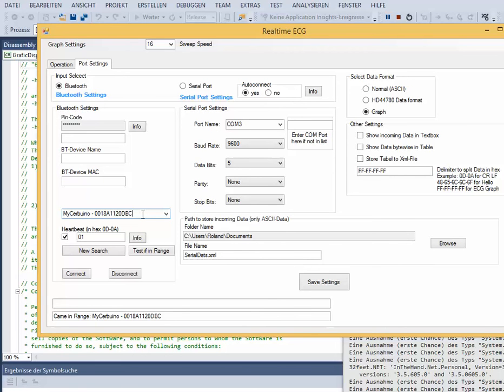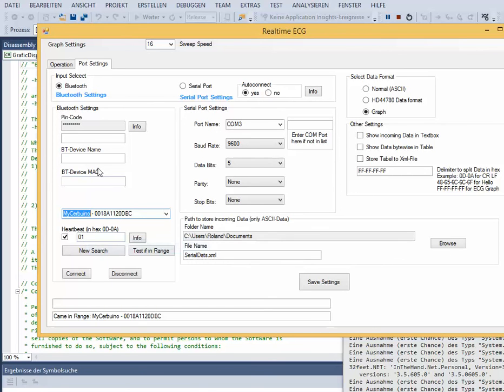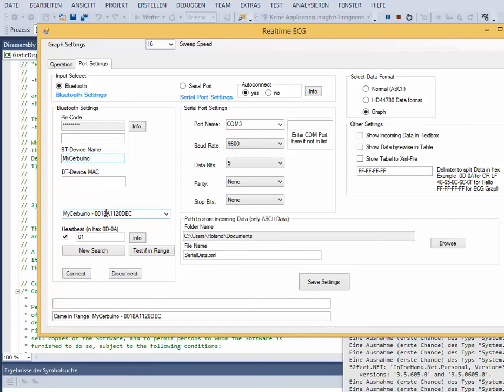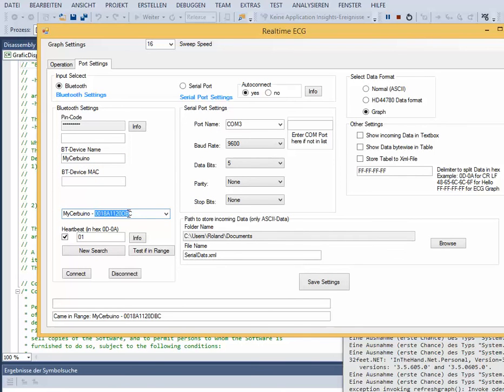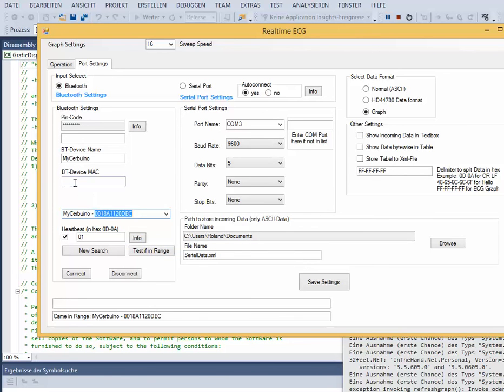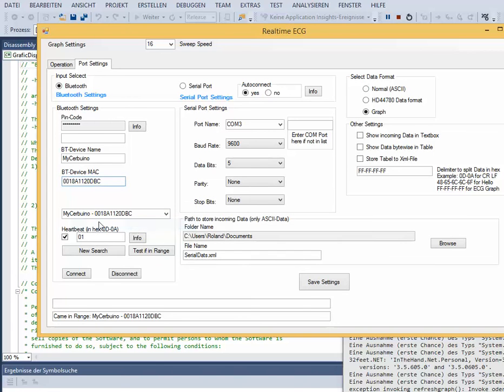If we want to use auto-connect, we must fill in the name and MAC of our Bluetooth device and apply the password.